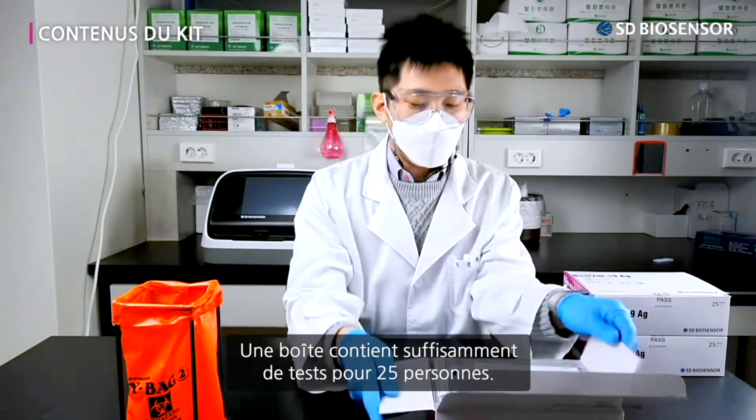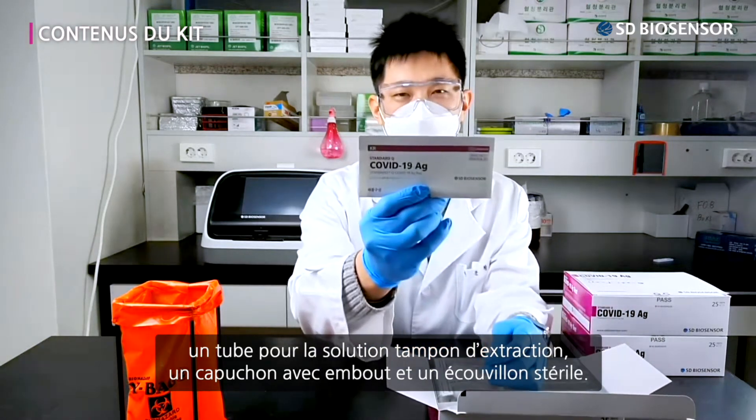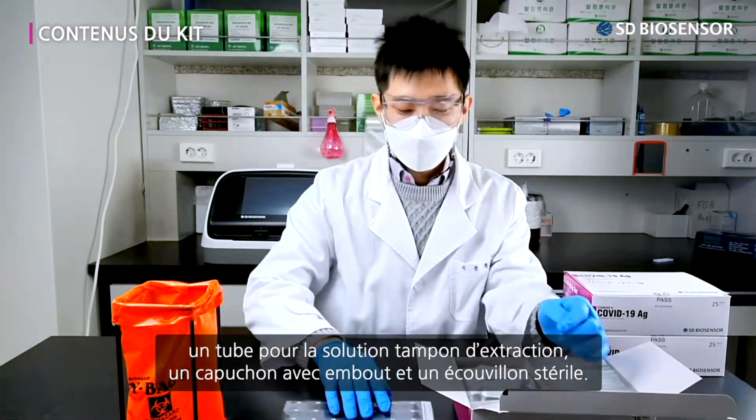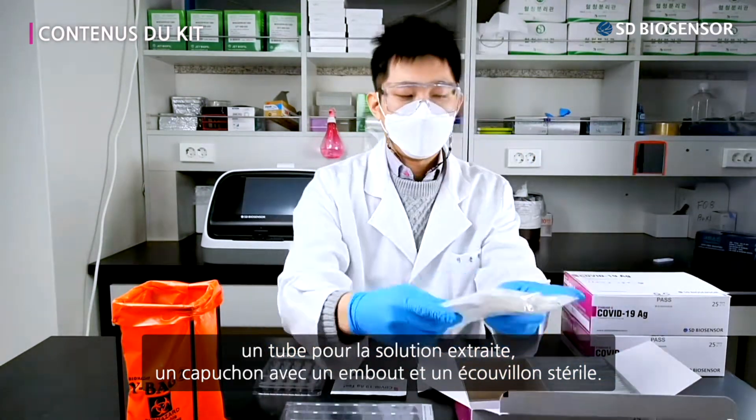In one box, there is enough to conduct tests on 25 people. The components are the instructions for use, film, test device, extraction buffer tube, nozzle cap, and sterile swab.